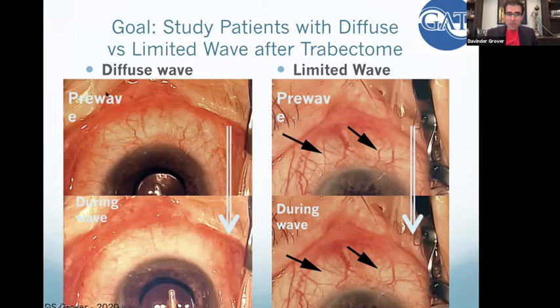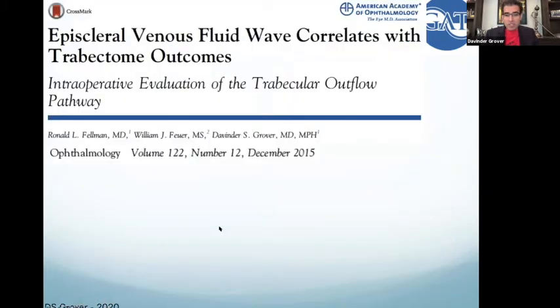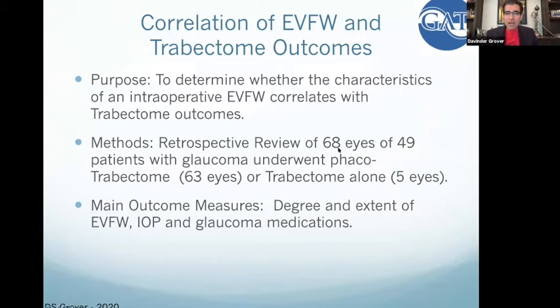So patients on the left side with the diffuse wave, where you see, before and after, this tremendous outflow, just blanching. And then here, where there's kind of a limited wave, where you can see maybe this little vessel went away, this little vessel got diminished. And we wanted to know if these two extremes, if those patients did differently afterwards. So we published this in 2015, 5 years ago now, in the Blue Journal, and we looked back at 68 eyes of 49 patients.